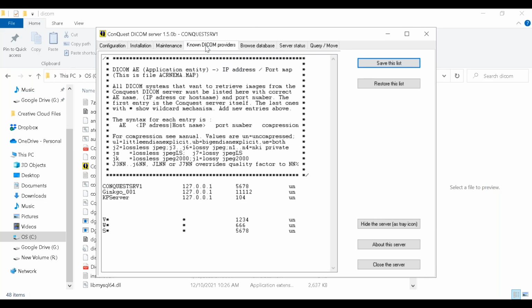This is probably the last thing you want to look at, and these are the DICOM providers. And the DICOM providers here are the pieces of software that I should talk to. These are the SCUs and SCPs that I should talk to. This thing is a little finicky. It uses essentially a notepad text file. So the question is, well, how does it know that these machines are different machines?